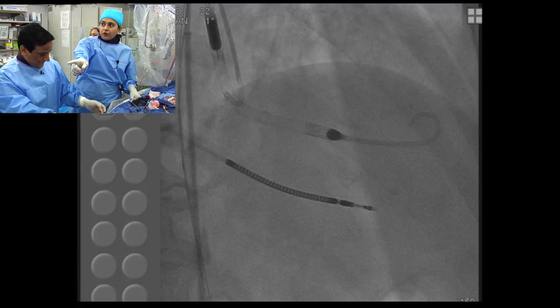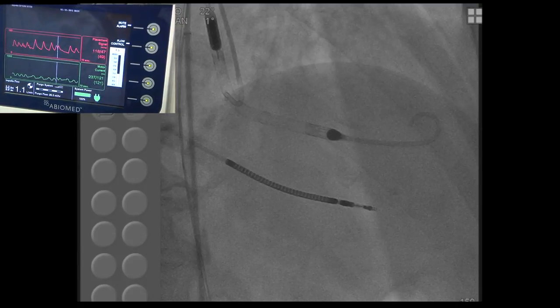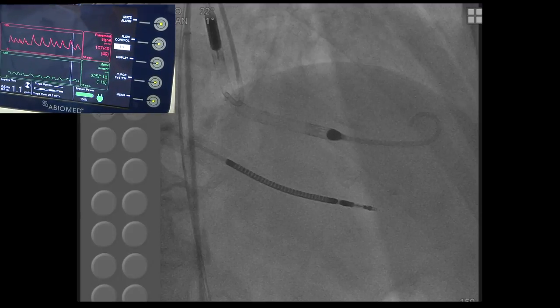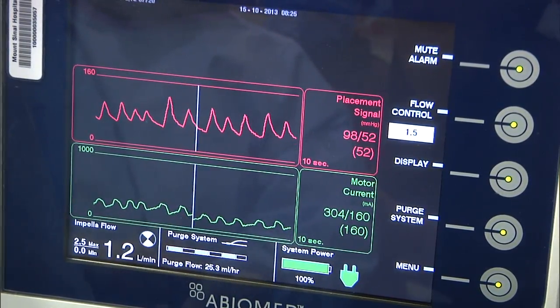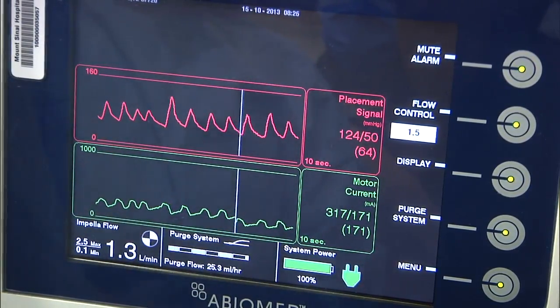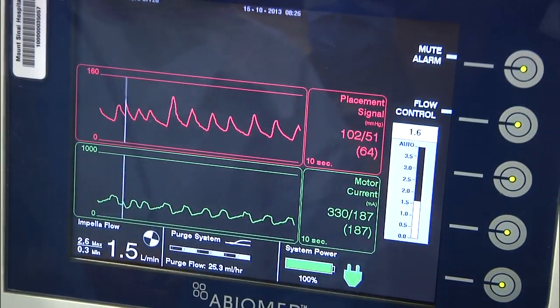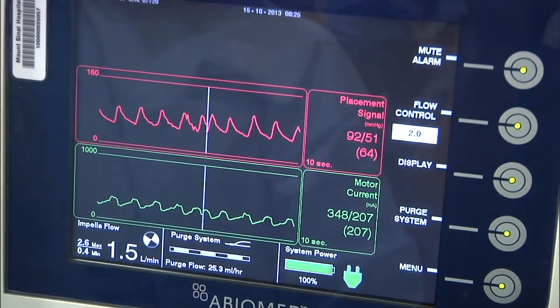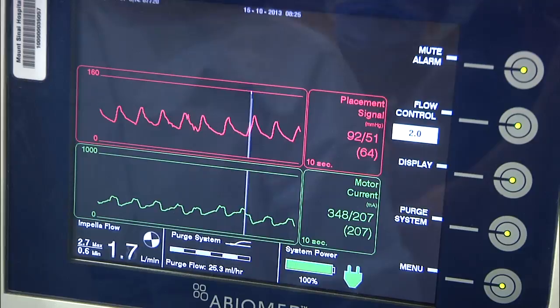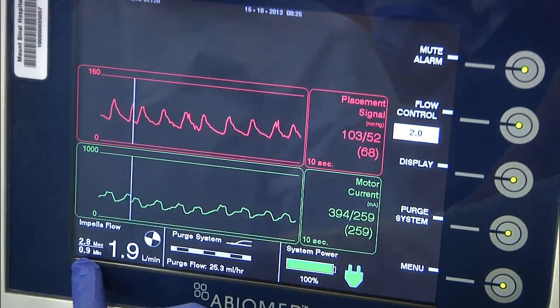And they're focusing on the console right now, which will explain everything as long as you know to read English, or if you can do it in Spanish and other languages, right? To get it all over the globe. So it will tell you, it primes and it will. We are okay? Positioning wise? Yes? Okay. And then all this prime pumps and everything comes handy so that it's all ready.